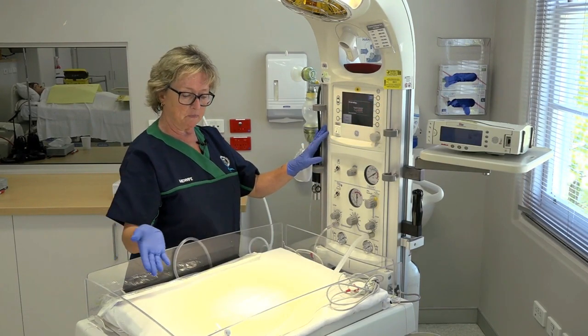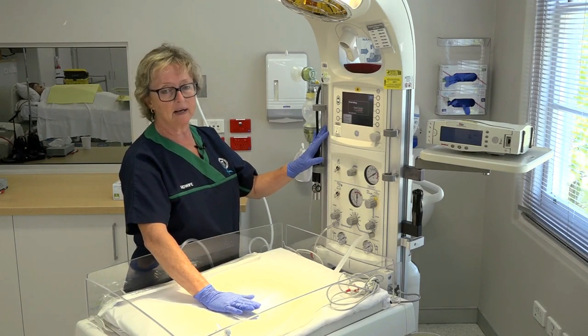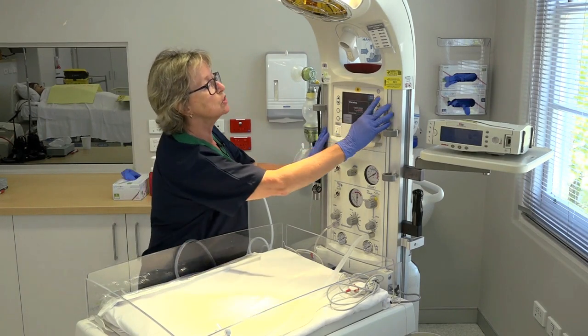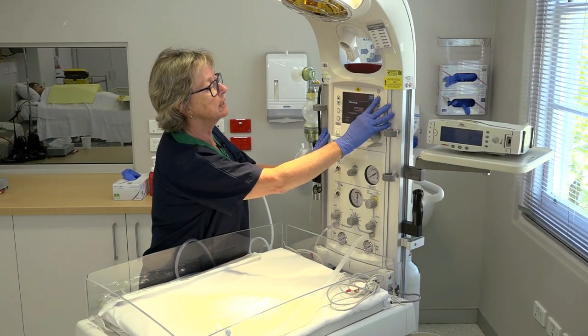Once the baby's body is born, or on the wards when the baby's body reaches the warmer, we will turn on the Apgar clock. At the moment we're not at seven minutes, so it's still warming up.